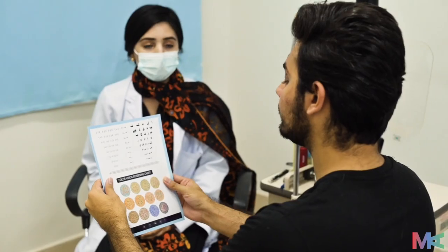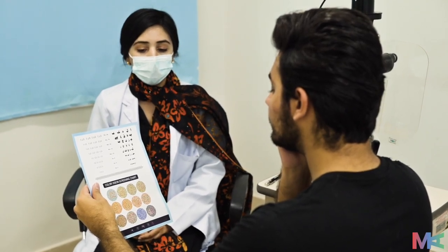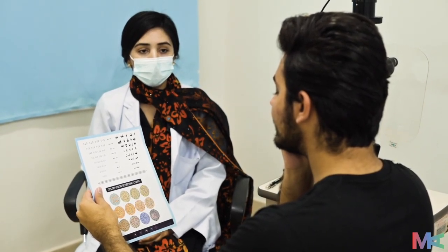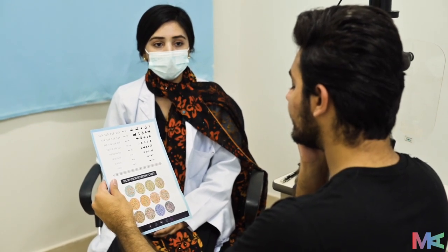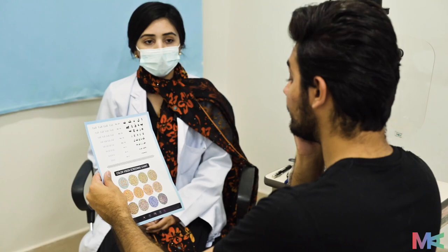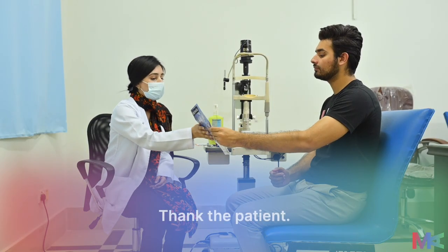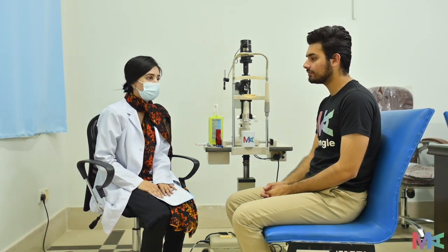Now close your left eye and kindly read the numbers for me: 12, 8, 6, 29, 5, 3, 15, 74, 6, 57, 5, 42. Alright, here is your examination done — thank you so much.